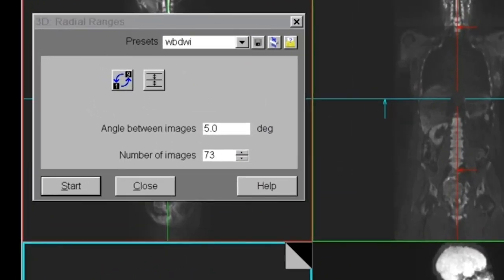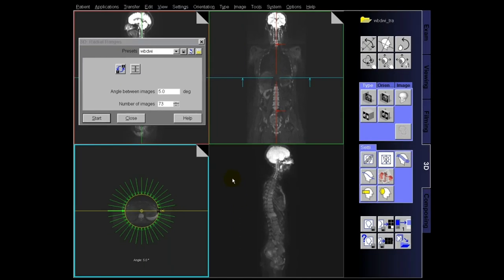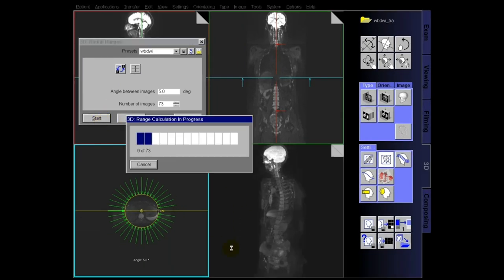The first time you do this, you can save your settings by clicking that button and renaming it to whatever you want. My preset here is 'Whole Body DWI' — I've already saved it. I just go in and find it, and it automatically positions with five degrees and 73 images. Then I just press start — fast and easy. This is b800. I'll save this one.